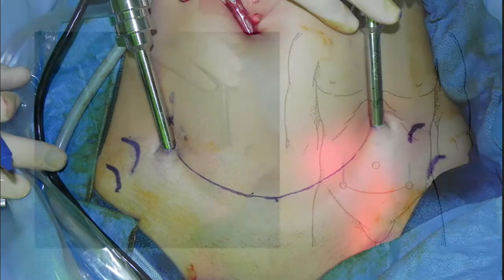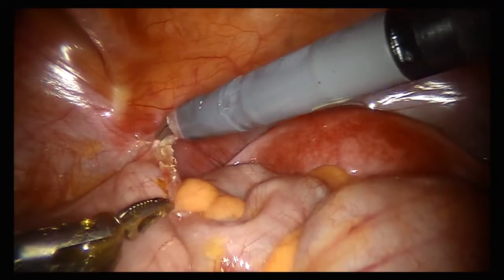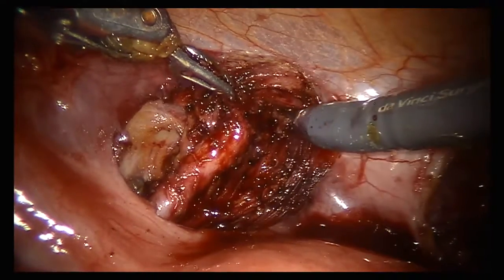This ensures advantageous ergonomics and proper instrument triangulation. At this stage, the relative laxity of the abdominal wall allows the ports to be gently translated superiorly with trocars in place, en bloc, to their final working position. The case then proceeds as normal. Even with HYDES port placement, visualization and ergonomics remain excellent.